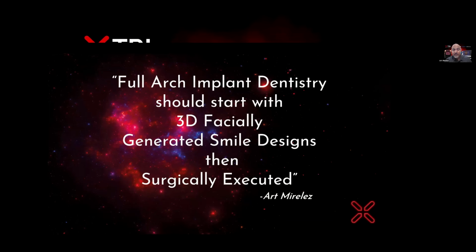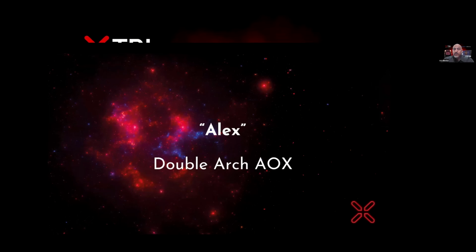It's actually backwards, right? Most architects, all architects, design first. We design the teeth in the face with the perfect smile. We can even let the patient sign off on it. Then we place the implants. Then we align the design to the implants. So let me show you a case.